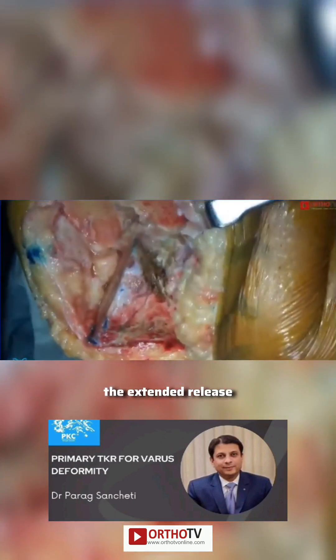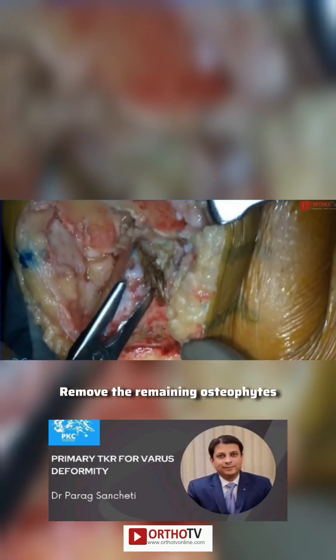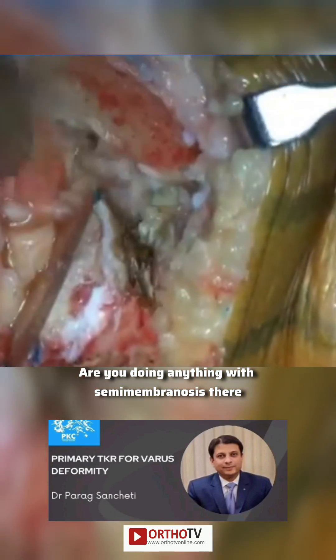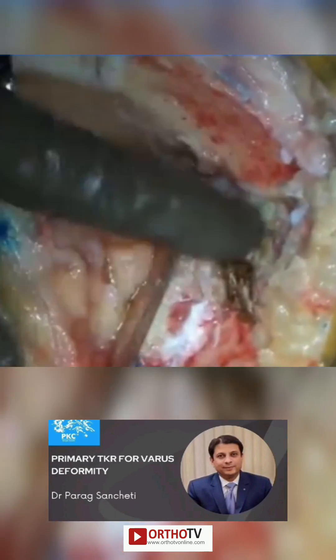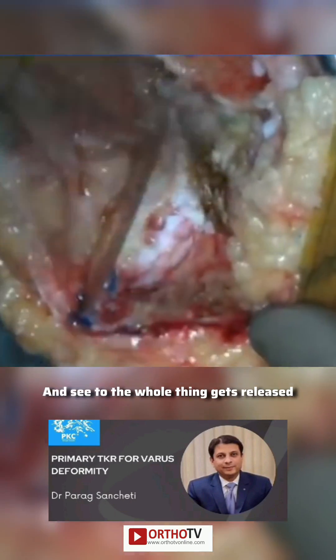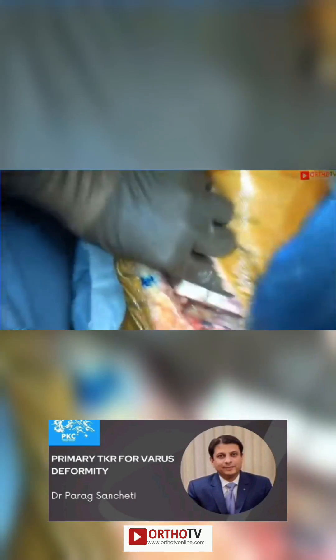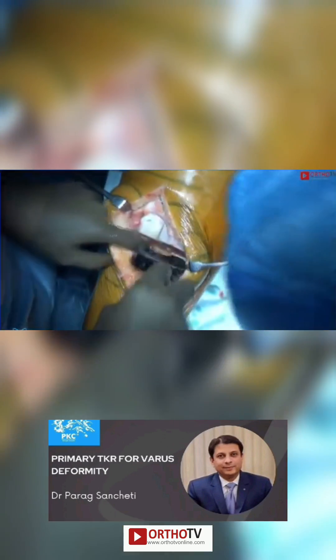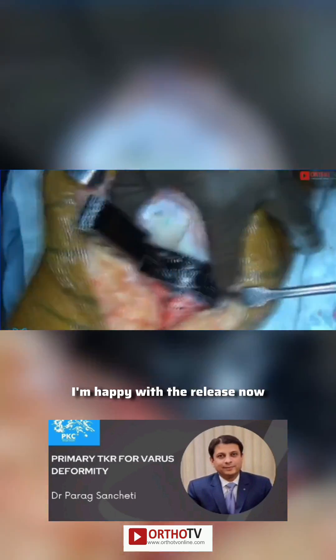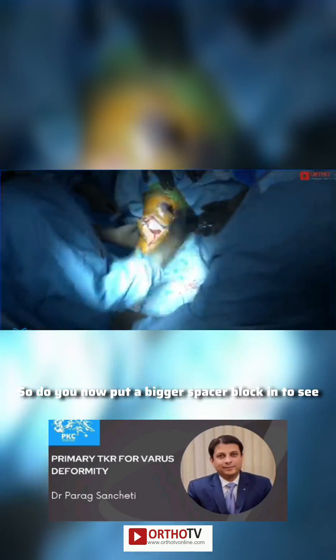This is the figure-of-four. The extended release — remove the remaining osteophytes. Can you see those? Yes, we got a good view. So you're releasing the deep capsule. Yeah, are you doing anything with semimembranosus there? Yes, it's all together with the deep MCL — the whole thing gets released. So now you can see — this is opening. I'm happy with the release.